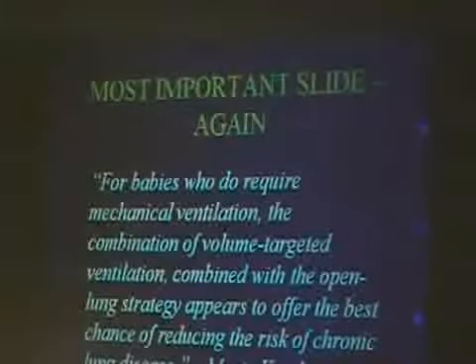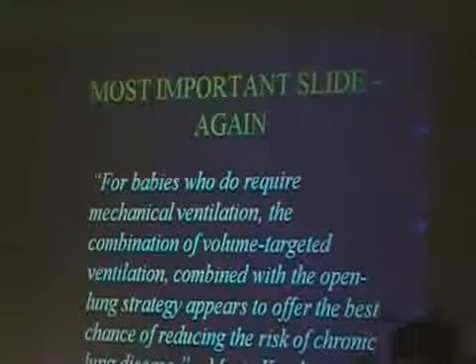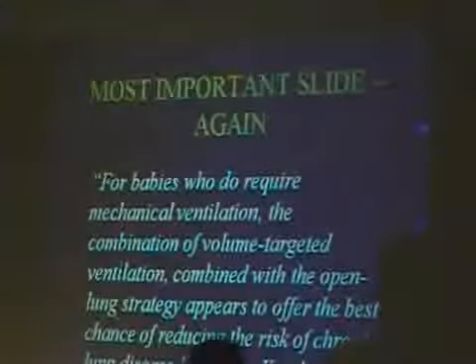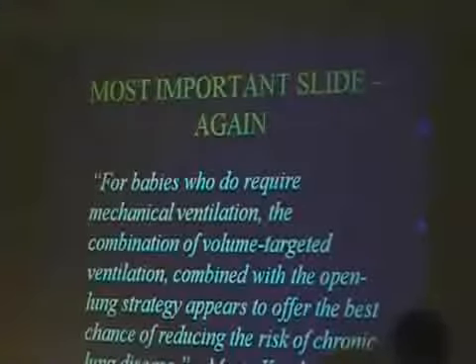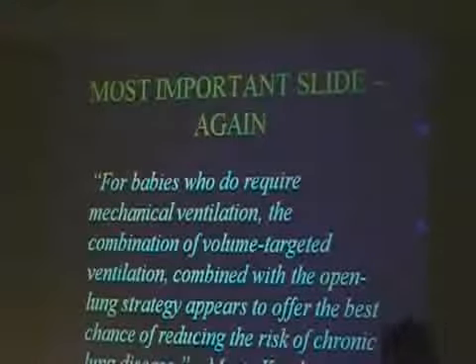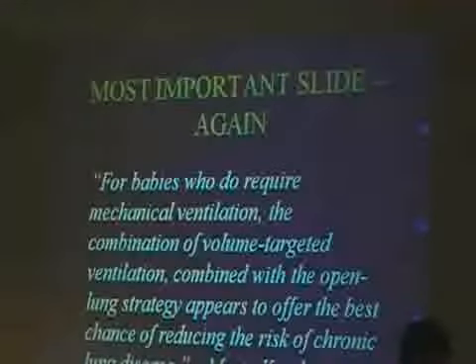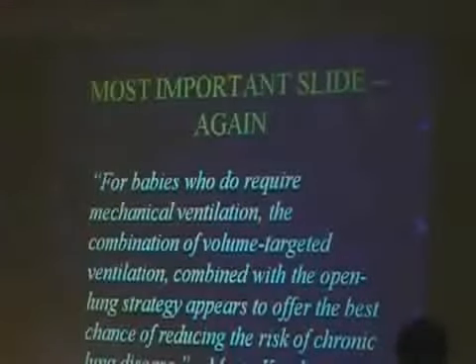Because what you're going to set is, I want you to deliver this volume, and the ventilator will then adjust the PIP to get to that point. If you set your PIP too low for the ventilator, then every time the baby moves or takes a sigh, your alarm's going to go off. But you don't really have to worry about that PIP being dangerous, because it's never going to get there, unless the baby requires it or he's screaming or something like that.